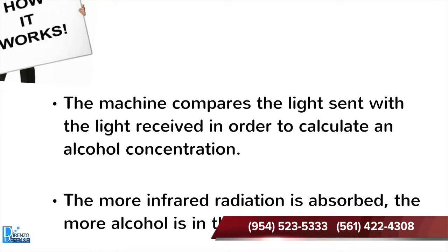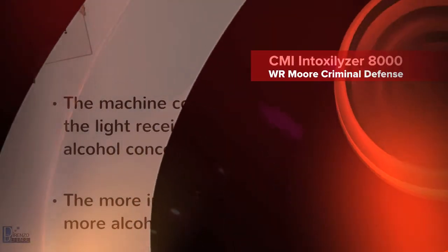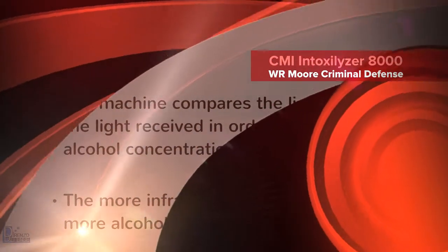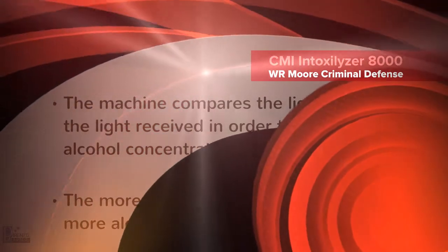So what we're saying in essence is this machine compares the light that was sent with the light received on the other end. In making this comparison, this machine is somehow able to calculate an alcohol concentration that was present in your lung air sample, which made its way into the breath chamber, and then infrared light was shined through it and measured.